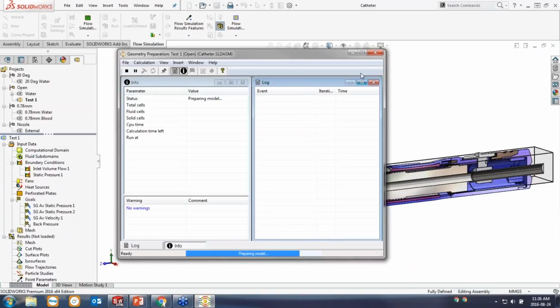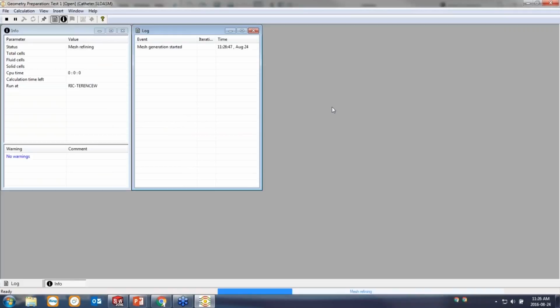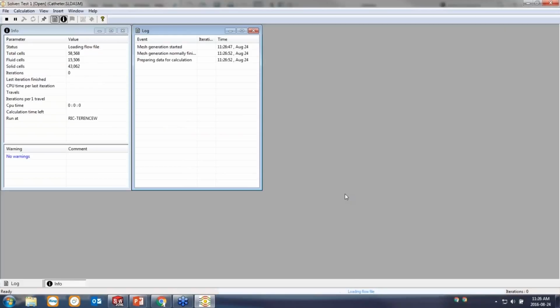Here's my additional solve window that's appeared. And you can see at the bottom there's a status bar. It's currently capturing the mesh. It's saving the mesh, and it's going to start running through iterations of the analysis. Now I mentioned this runs pretty fast, so I'm just going to quickly hit pause on this analysis so I can talk about the two main things that you'll want to do while an analysis is running.